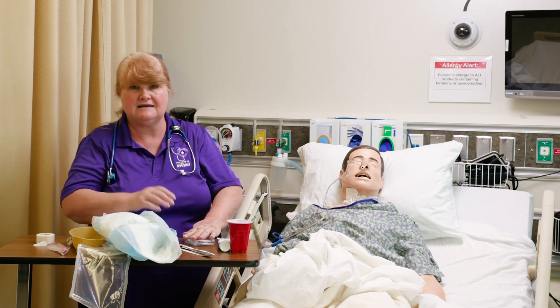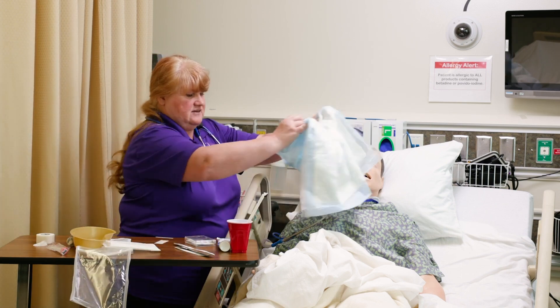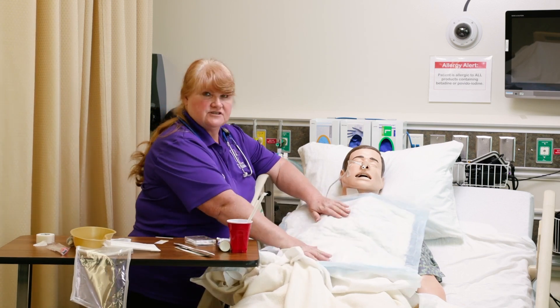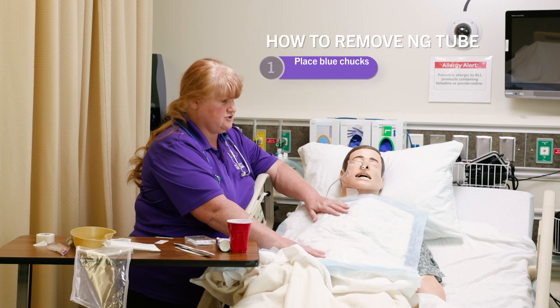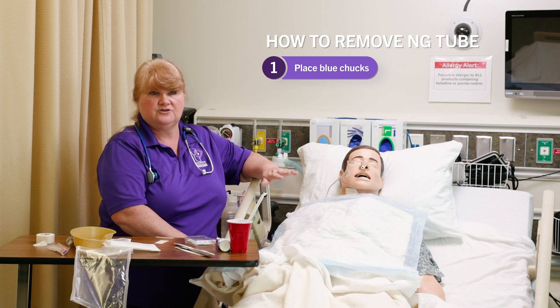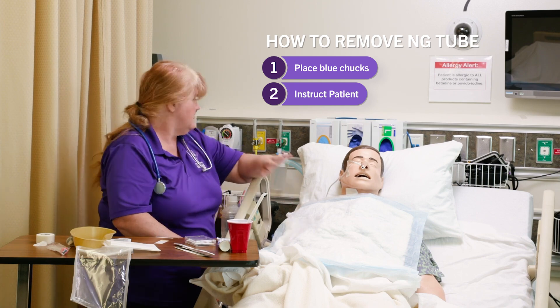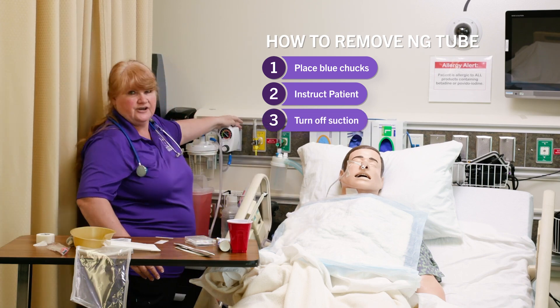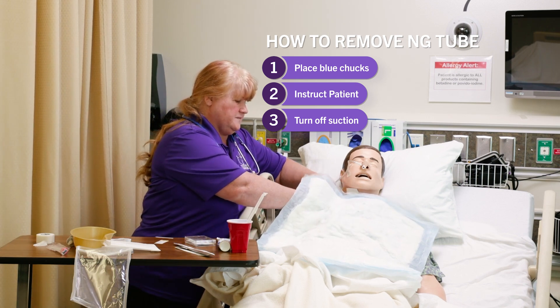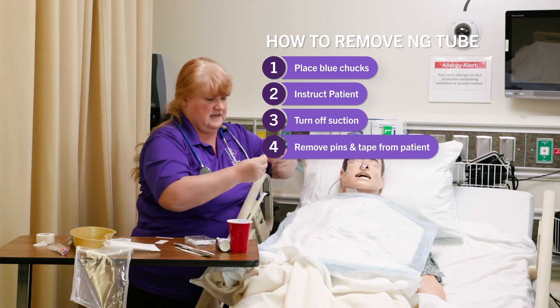Now your patient has gotten better and we're going to take the tube out. The doctor has given us an order to remove the nasogastric tube. The first thing we're going to do is put the blue chucks on the patient. Explain to the patient that you are now going to take this out — they will be very excited about this. Turn off the suction and undo the safety pin from the patient.